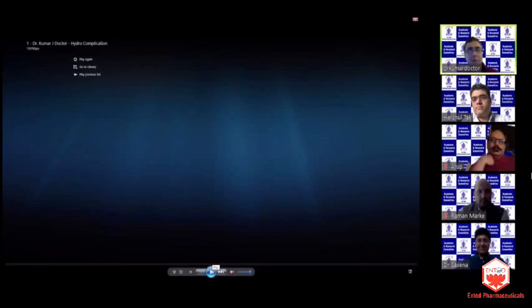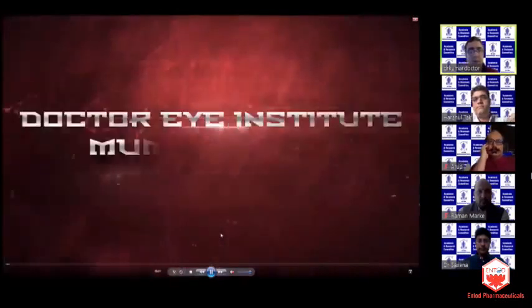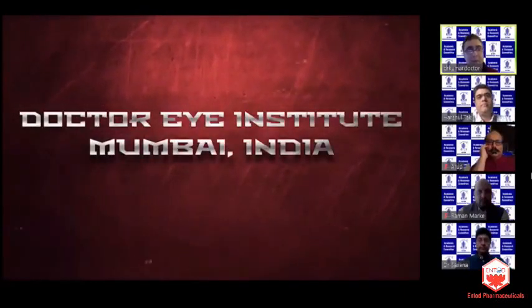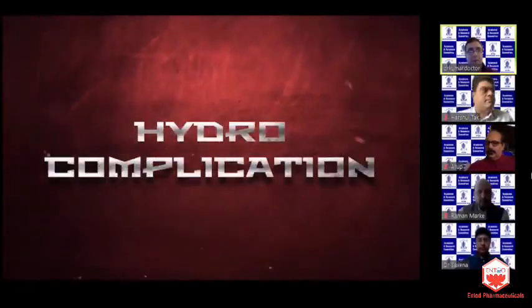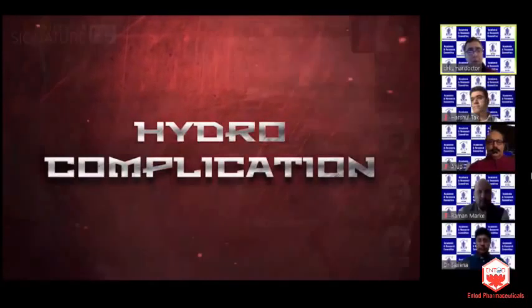So I'm going to show two videos. Can I have my video on, please? This is a first case of a simple procedure of hydrodissection and another case of miosis during phacoemulsification. So the first case is a hydro complication and how we get away with the problem.